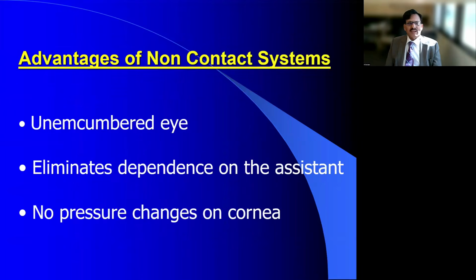Well, what are the advantages of non-contact systems? They're unencumbered. So basically, there is no crowding in the area where you're operating.